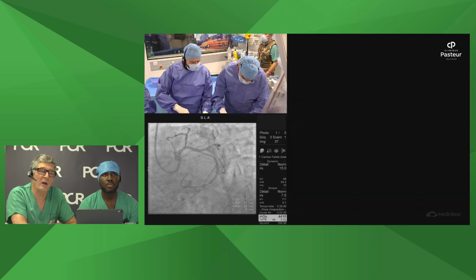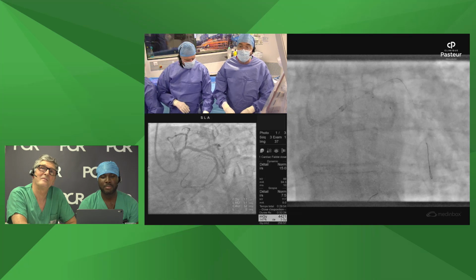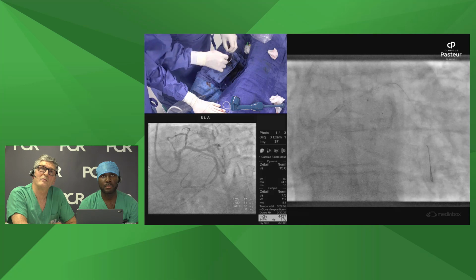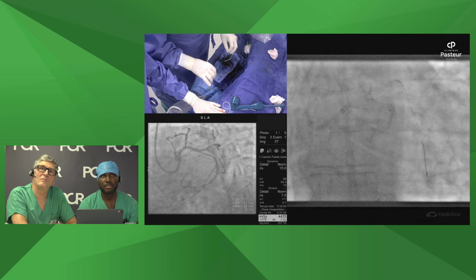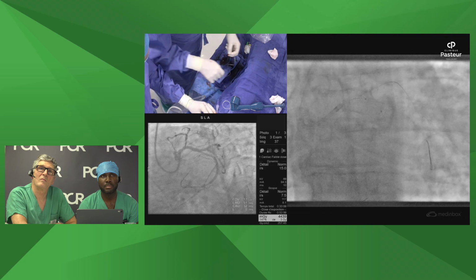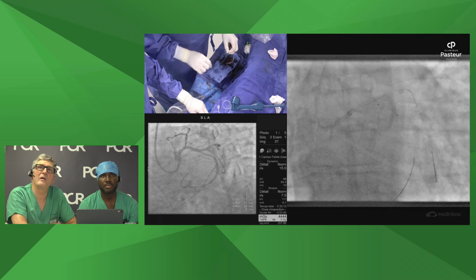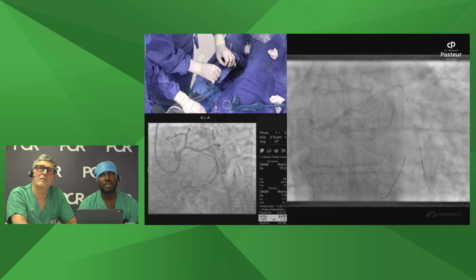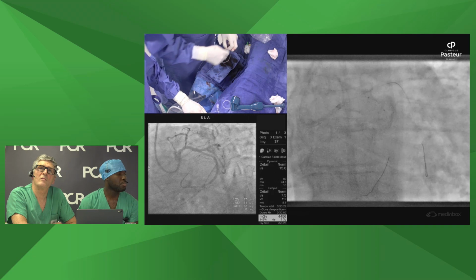Right. Yeah, we're preparing. What I've done is to place the 4.0 millimeter balloon a little bit distal in the circ, in order to avoid having the balloon itself inside the bifurcation at present, and then I will pull back the balloon. So the other balloon is non-compliant or semi-compliant? The 3.5 is a semi-compliant. Semi-compliant, okay. But it's already been used once.